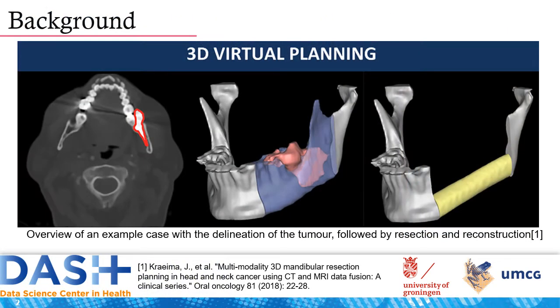As you can see in this example, the surgical removal of a tumor close to the mandibular bone often needs the resection of the mandible. 3D virtual surgical planning provides precise clinical guidelines, and the surgeon can acquire operative information from the 3D virtual surgical planning.